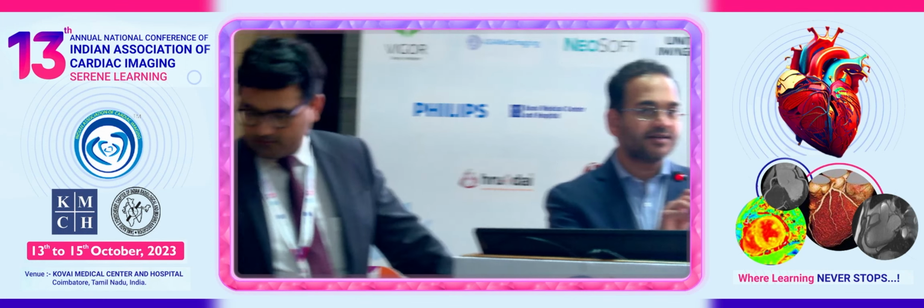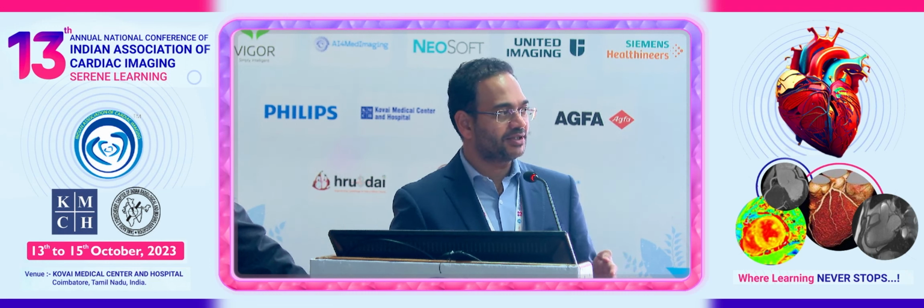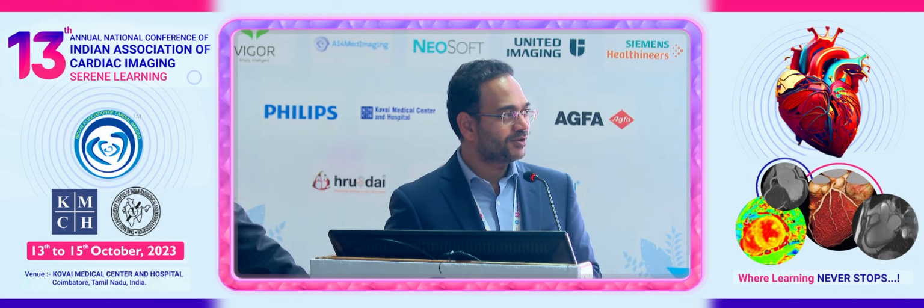So a couple of things. I think it's a really practical question and a really practical real-life scenario that not everybody gets multiple serial coronary CTs to assess how the plaque is progressing over a period of time. So there is not a large multi-center study that has looked at that. And also, when we do coronary CT and there is no plaque, the warranty period for a negative coronary CT is generally considered around 2 years, at least in the United States.